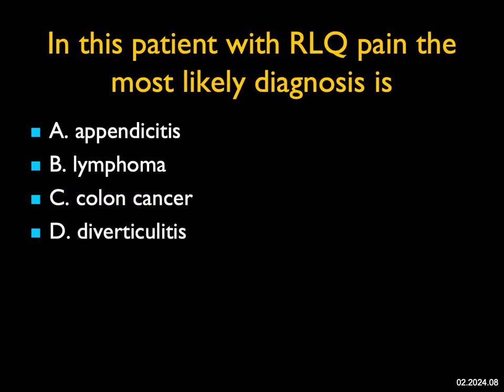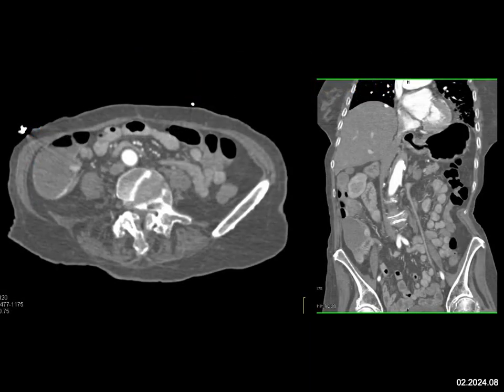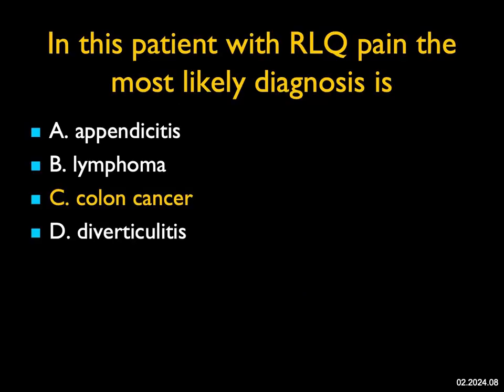In this patient with right lower quadrant pain, what you see is what looks like a small nodule in the cecum and there's high density representing blood. So this is a case of bleeding in the cecum. It's not appendicitis. It's not bulky enough for lymphoma. I don't see right-sided diverticuli, and right-sided diverticulitis is fairly uncommon, though it does occur. The most likely answer with a nodule and GI bleeding is going to be colon cancer. This was a small colon cancer.